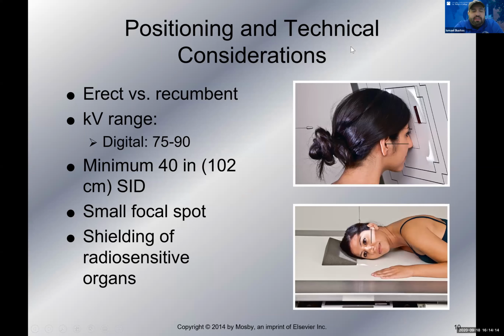All right. Some more positioning and technical considerations. Again, we are moving along from page 405 right now. This would be page 408. Okay, so we look at erect versus recumbent position. There are advantages to each of these, right? Erect is generally the best position we want to get the patient in, normally because, one, it's for patient comfort, right? If there's injury to the head, we don't want them laying on it or putting pressure on it.